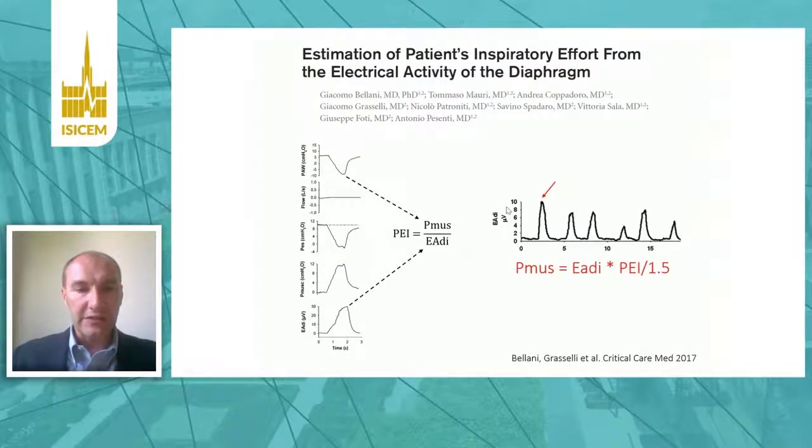Another possibility is to estimate muscular pressure from the electrical activity of the diaphragm using this PEI index that we proposed together with Giacomo Bellani, again during an inspiratory occlusion against the occluded airway.